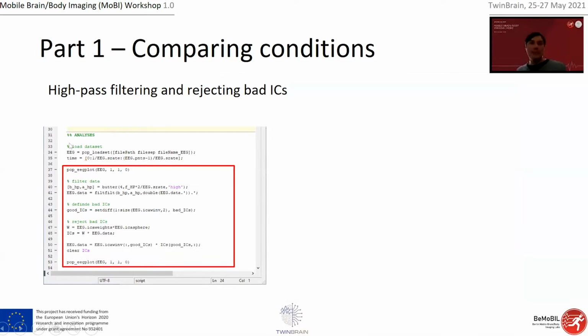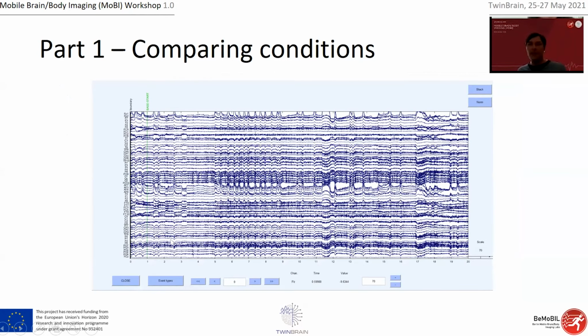First of all, we try to load the data here and just plot it. And I think before doing anything with data, especially if you didn't record it yourself, it's important to look at it. So I just load it and plot it. That's it. And what you can see here is, I think, 20 seconds of EEG, and it's quite nice recordings, but there's also quite some noise in it. And those guys here, they're just eye artifacts, very, very clear eye artifacts.